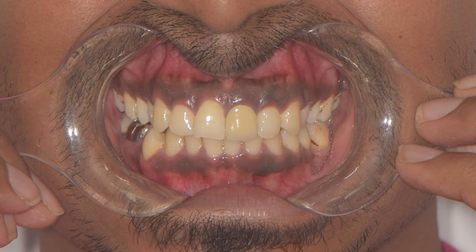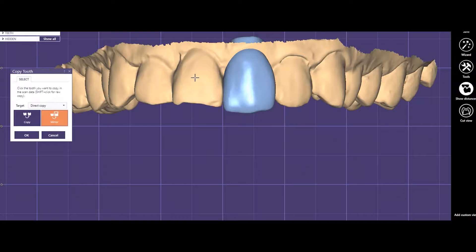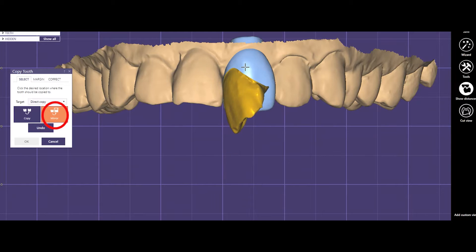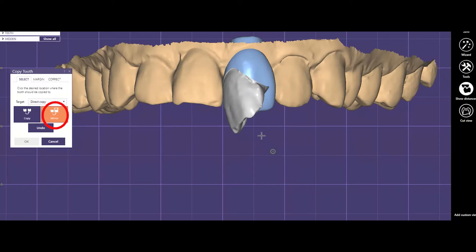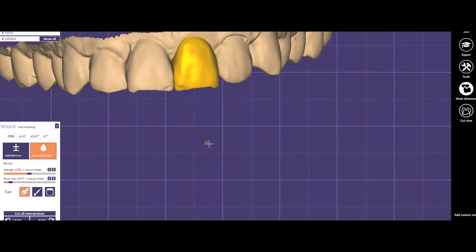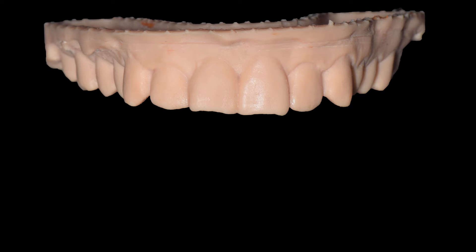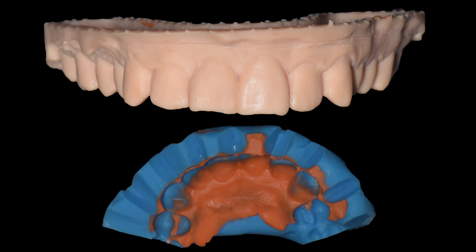I want to show you how we could achieve a good result with the digital workflow in this particular case. Because I want to mimic the shape of the 1-1 for symmetry, I have made a pre-op scan and sent it to the lab. The technician can use this to create a mockup by copying the adjacent central incisor onto the 2-1, and he can send me a printed model from which I can make an index and give the patient a provisional restoration as well.